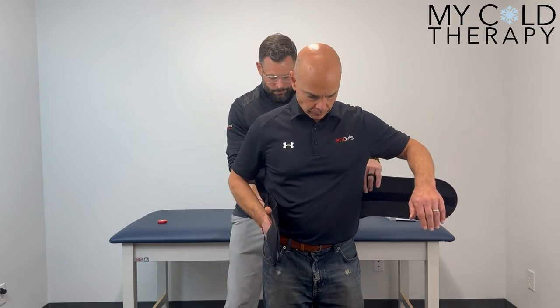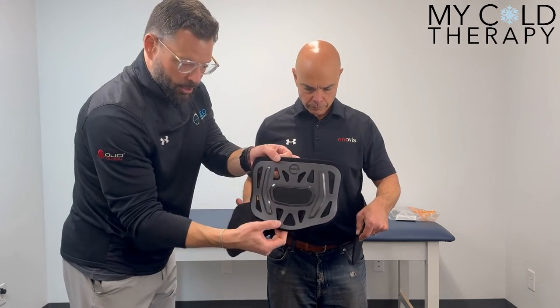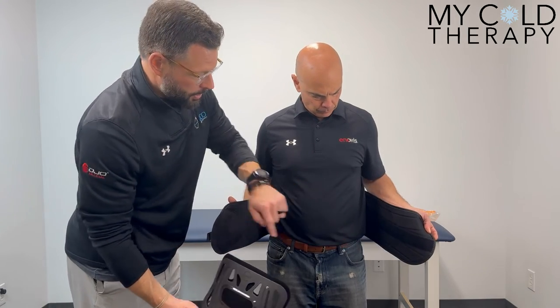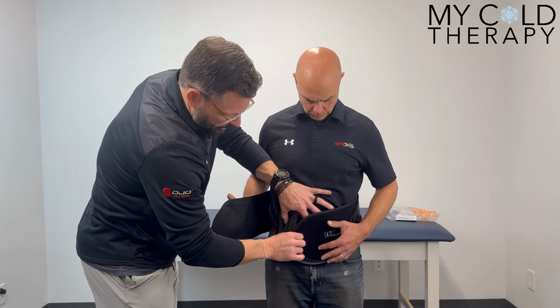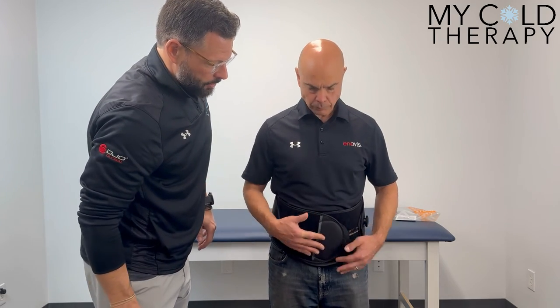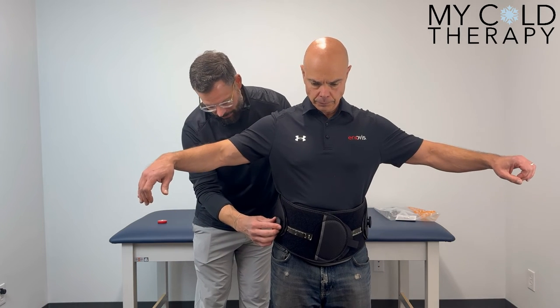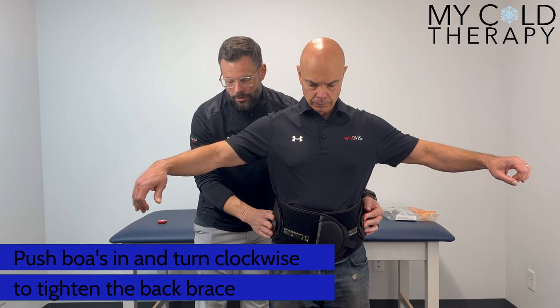We're going to come around the patient to the front. Before we have them in closure, our interior panel with our velcro is going to velcro right on the inside of the brace. We're going to sit down at the bottom of the abdomen, come right across, wrap, and then have our patient take the right hand side wrap as well. We've got our boa dial — we're going to push it in until it clicks.